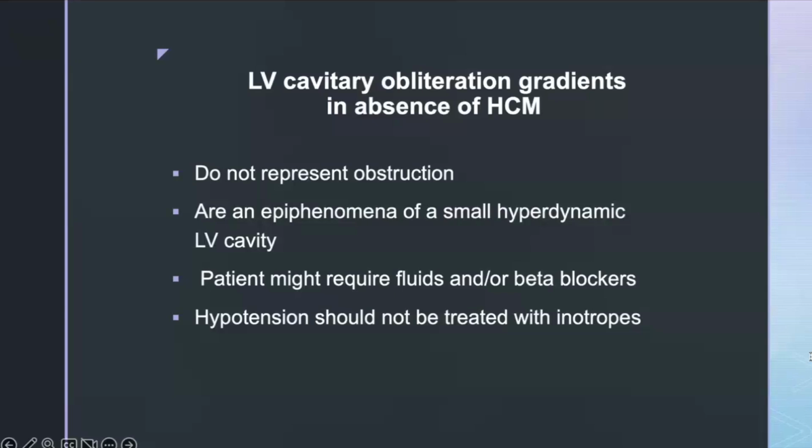The reason is because it's really just an epiphenomenon of a small hyperdynamic cavity. It doesn't have as much clinical significance as obstruction, and it might allow the clinician to be a little less concerned and trigger them to think of things such as the patient requires fluids or beta blockers, or this hypotension should not be treated with inotropes. It should be treated with fluids.